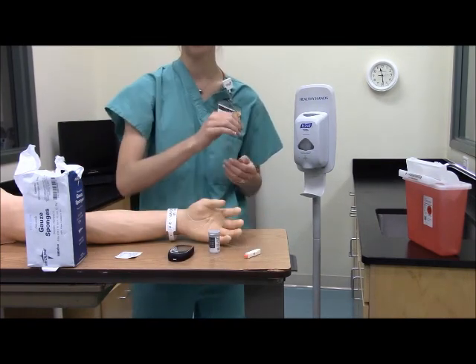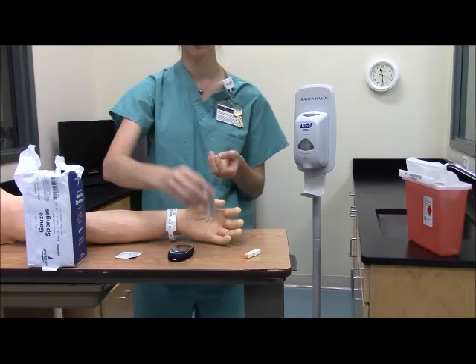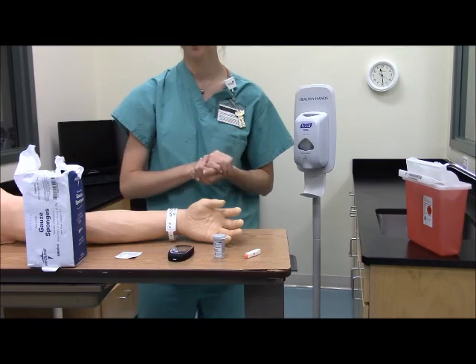Let's go ahead and take a look at the test strips and make sure that they haven't expired. Now we're going to perform hand hygiene.